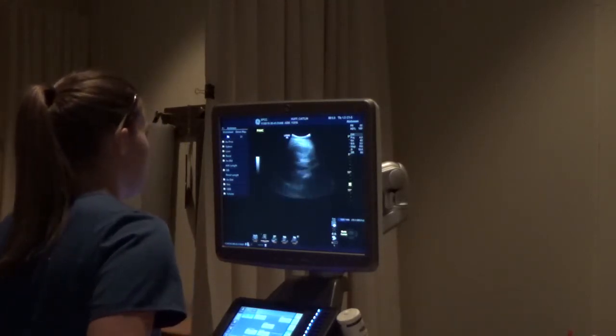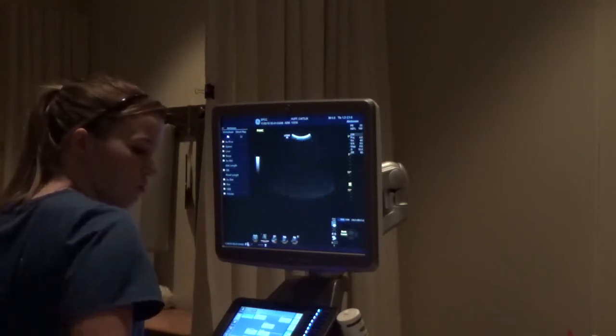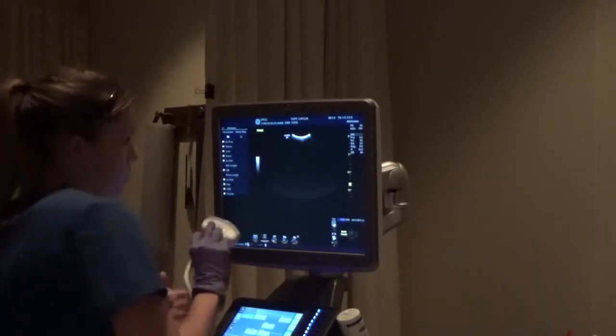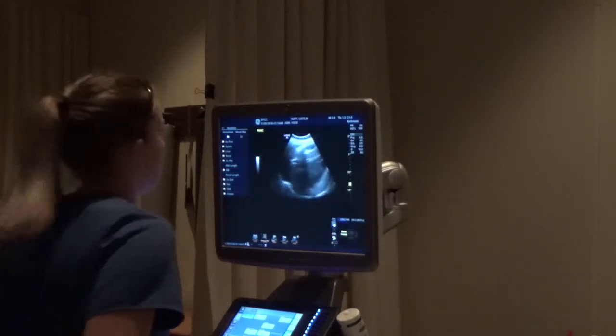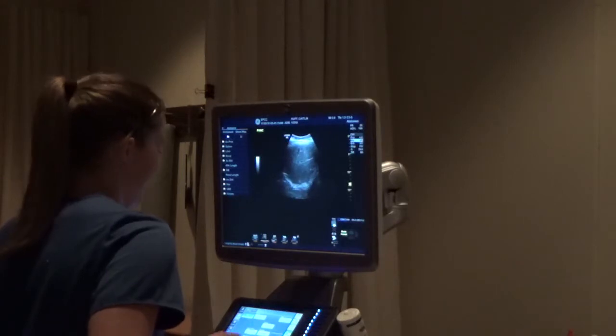All right, let me have an image of the right lobe of the liver, sagittal. And you can store that. The dome specifically, Caitlin. The dome? Yes. Okay. What she said. Thanks.